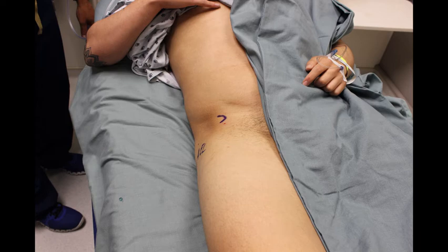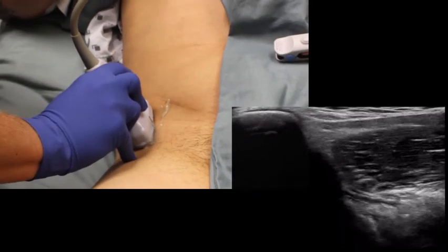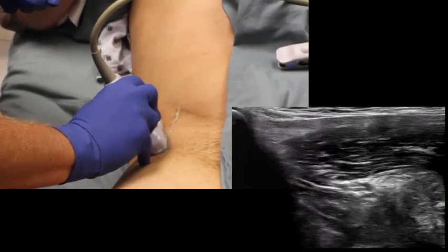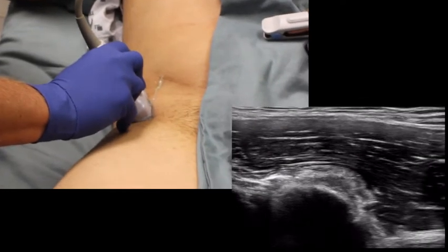Palpation and identification of the ASIS is important. This is the starting point for the ultrasound. A linear ultrasound probe is placed in a longitudinal plane over the ASIS and oriented so that cephalad correlates with the left side of the ultrasound screen.